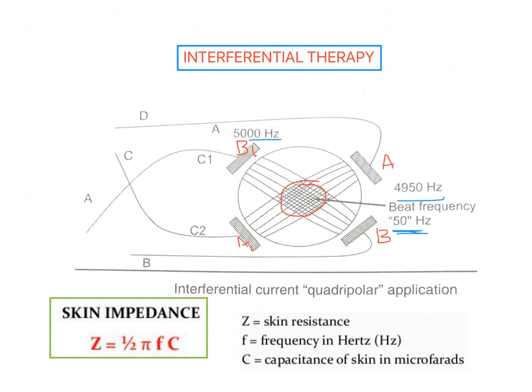So up to 1 to 100 means you can choose 1 to 50 or 1 to 20. If you choose 1 to 20, throughout the treatment 1 to 20 hertz is used. The same kind of frequency is always constant throughout the treatment.